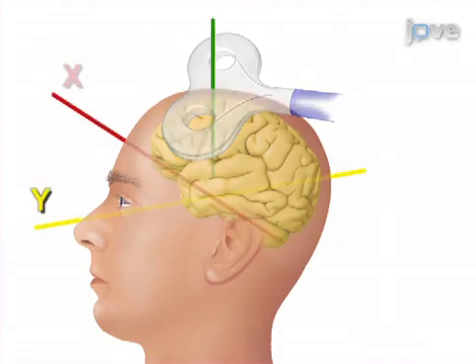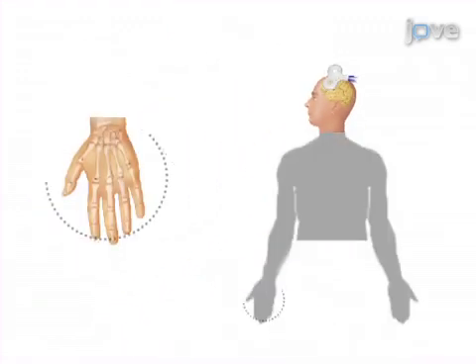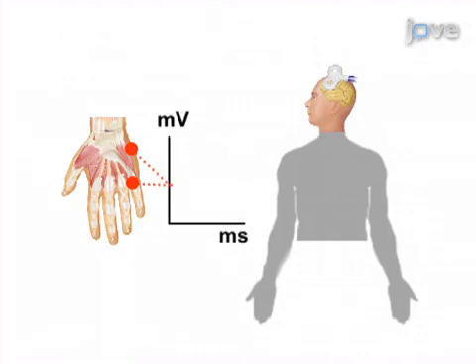As a second step, neuronavigation is used to maintain constant TMS coil positioning throughout the entire experiment. Next, electromyographic activity is recorded from hand muscles in order to track excitability changes induced by action observation.